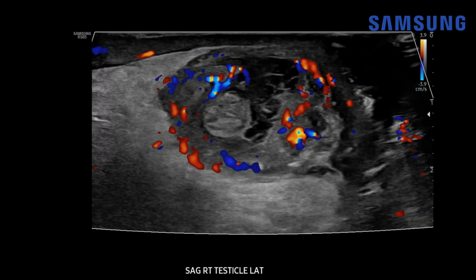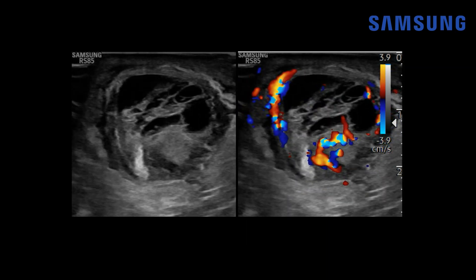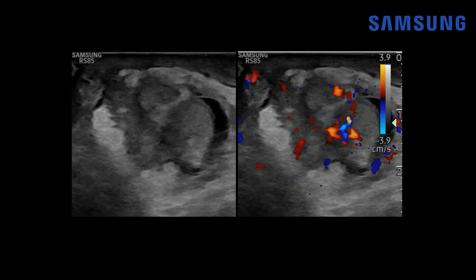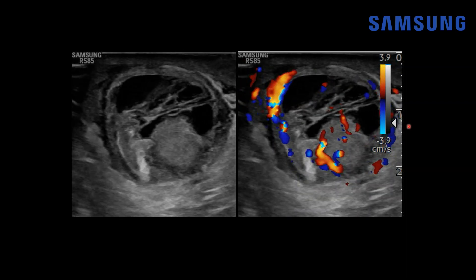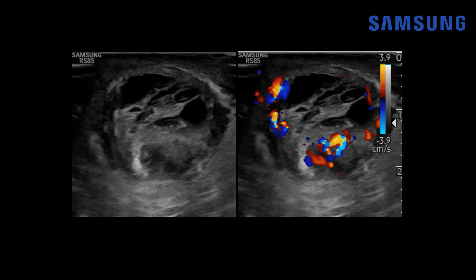With color Doppler, similar to the previous case, there's no internal vascularity within this torsion appendix, but we do see hyperemia and reactive epididymitis in the adjacent epididymis as well as the surrounding soft tissues. Looking at a dual screen cine clip color transverse image, we again see the marked hyperemia surrounding the scrotum — the torsed epididymal appendix, the adjacent hyperemic epididymis, the normal testis, and the complex hydrocele.